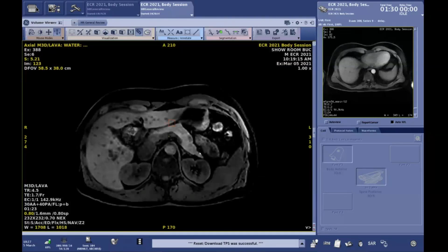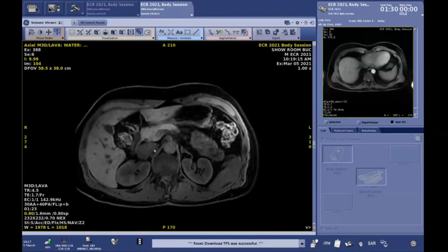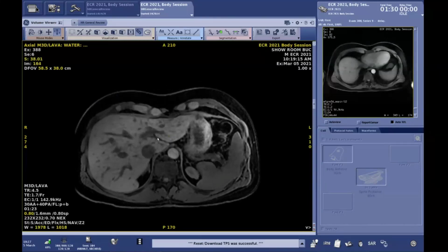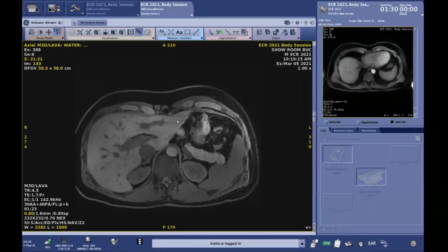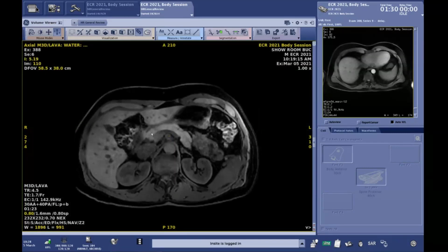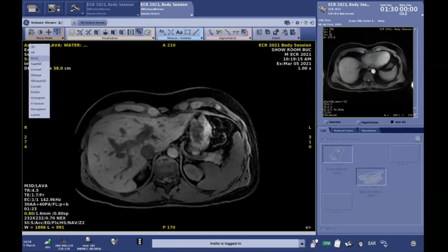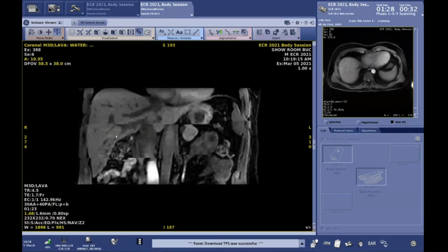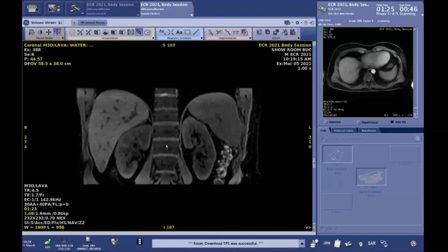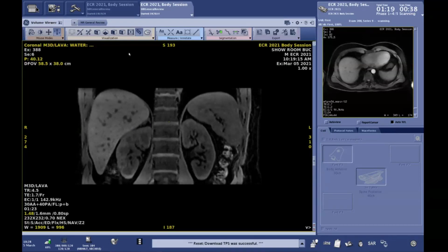This one was our 1.6 isotropic navigated sequence, and you can see here for the pancreas we have a really great visualization. I will try to not scroll too fast for you. And for the liver as well, we have really great details. And here we have this capability again to reconstruct multiplanar images. In coronal, for example, for the kidney here, we have a good visualization of the kidney in the 3 planes. And we have a really good capability of reconstructing the images.